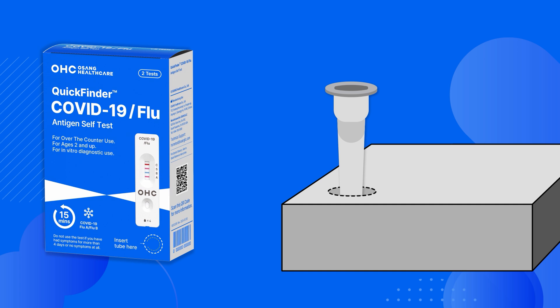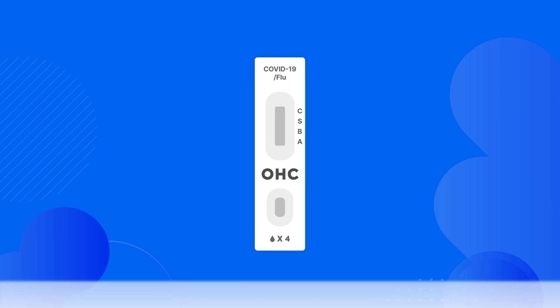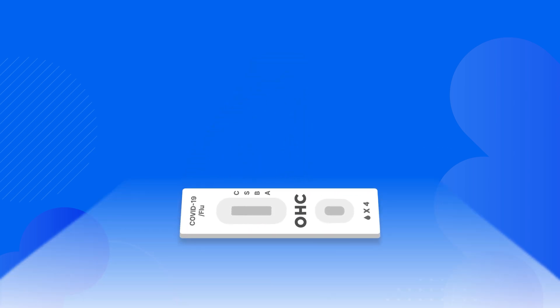Push the extraction buffer tube into the perforated tube holder located at the front of the box, labeled Insert Tube Here — a dotted circle on the bottom right corner of the front side. With the box lying flat, lower the tube into the holder. Meanwhile, open the pouch that contains the cassette and place the cassette on a clean flat surface. The white and blue pouch tears open and the cassette slides out onto a flat surface.